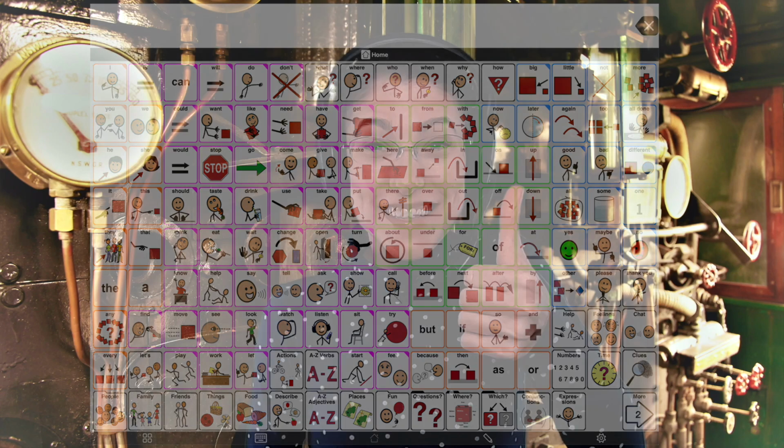As we work our way through this video, I'll show you some basic ways to get started on your child's device. Believe me, there is too much practice needed to become a communicator for the speech therapist to fit it all in during their session each week. Your child needs to see how communication happens everywhere he or she goes. Buckle up and have fun.